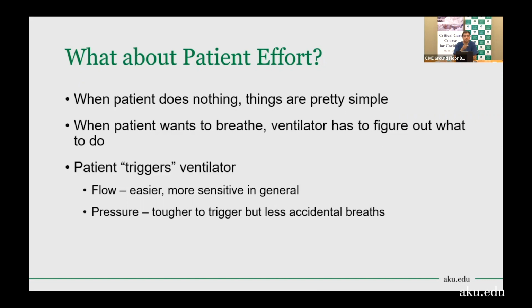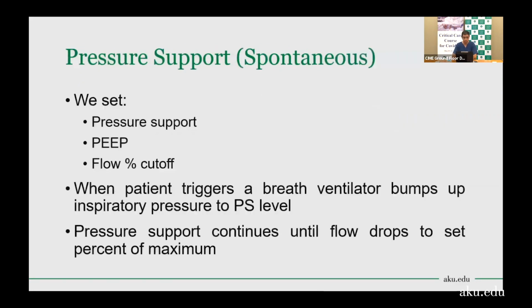This effort will be measured by the flow sensor or the pressure sensor at the end of the ET tube, and it will tell the ventilator that yes, this is the minimum trigger setting that we have. If it is triggered, it will deliver the volume as per setting. If it is not triggered, the ventilator will deliver what it is.